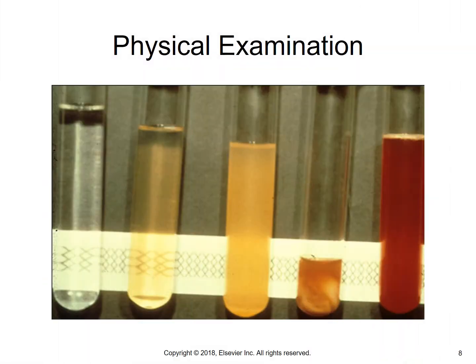So on these types of specimens, we want to perform a physical and a microscopic examination of the fluid. So let's talk about the physical exam, which includes the assessment of color and clarity in addition to viscosity for synovial fluids. So normally, the synovial fluid will appear pale yellow or colorless and clear. Any variations such as red or brown can be associated with trauma during the process or with any disorders that disrupt that synovial membrane.